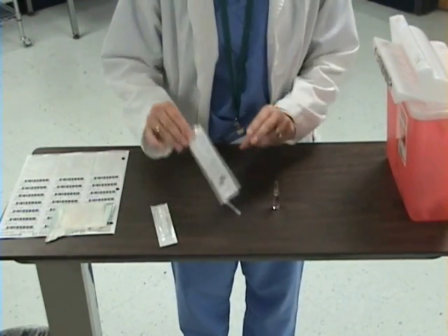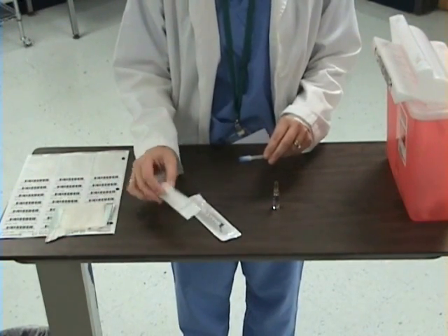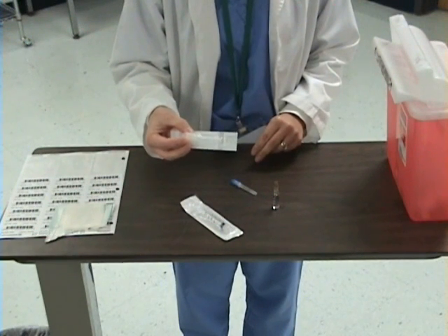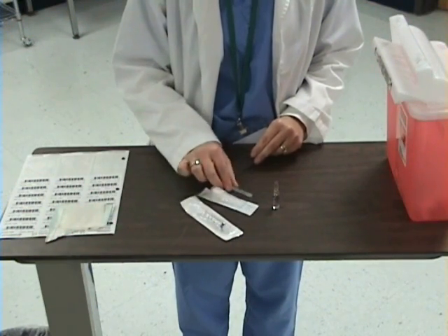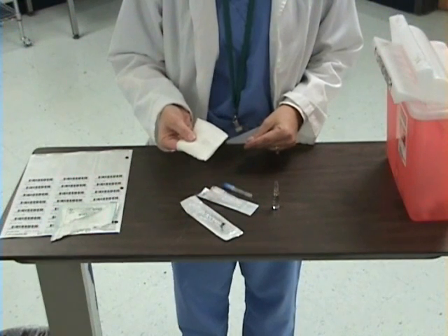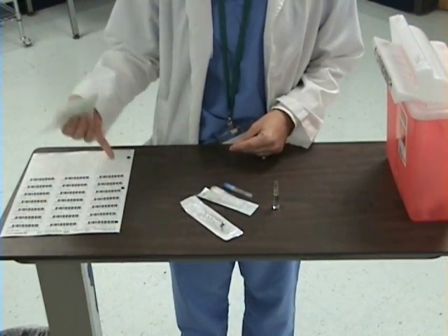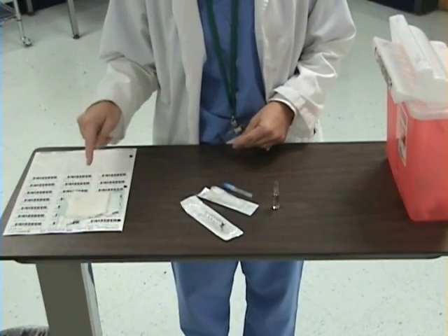I need a syringe that is the size that would hold the medication. I need two needles. One needle needs to be filtered, which I will touch on in a moment, and the other needle is for administering the medication to the patient. I also will need a piece of gauze to open the ampoule — a sterile 2x2 or 3x3, or an alcohol prep would work. A patient label to label my syringe with the medication, a trash container, and a sharps container.